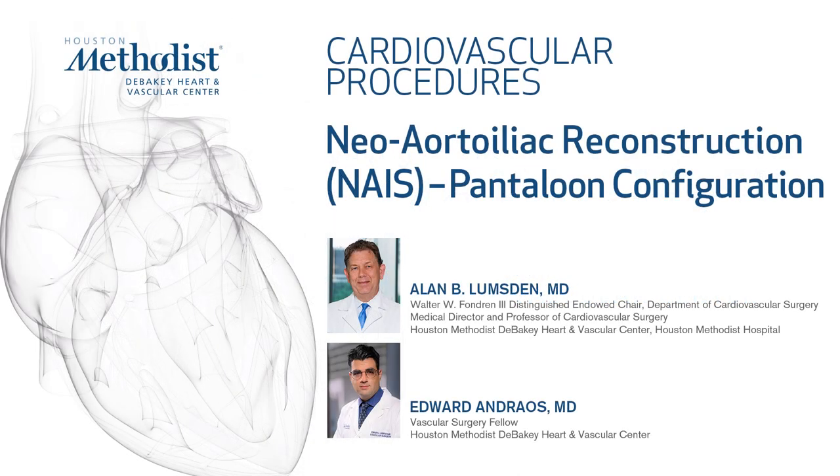In this video, we will be demonstrating a neo-aortoiliac system reconstruction using pantaloon configuration.